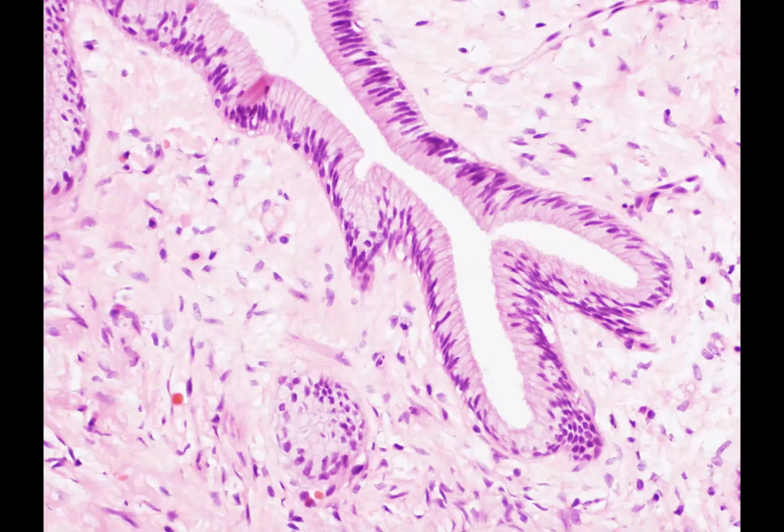Now, in order to appreciate abnormality, you have to appreciate what is normal. This actually is an H&E of a normal endocervical crypt, or crypts in fact, because we've got one that's cross-cut here. And just pointers. First of all, we have a lovely extensive area of endocervical type epithelium. And I want you to see that they're not all right at the bottom sitting on the basement membrane.